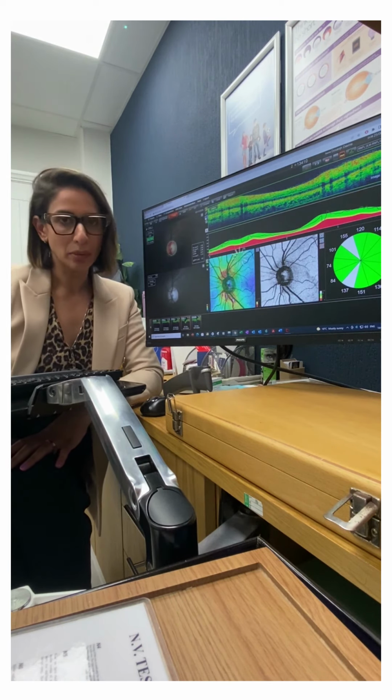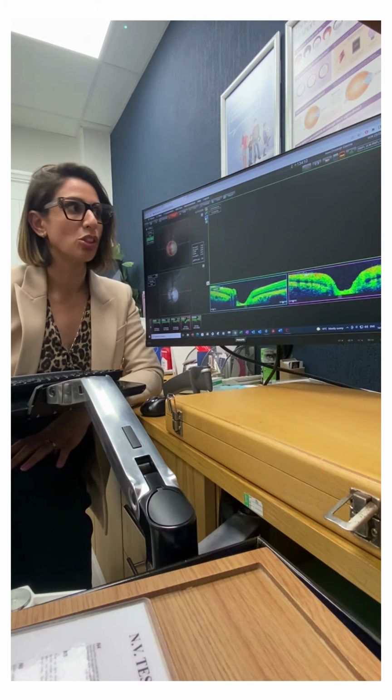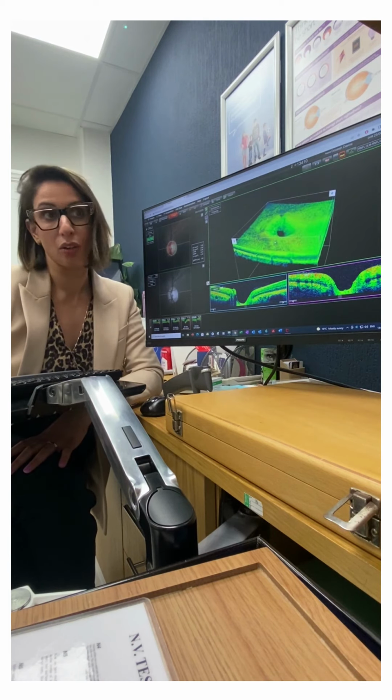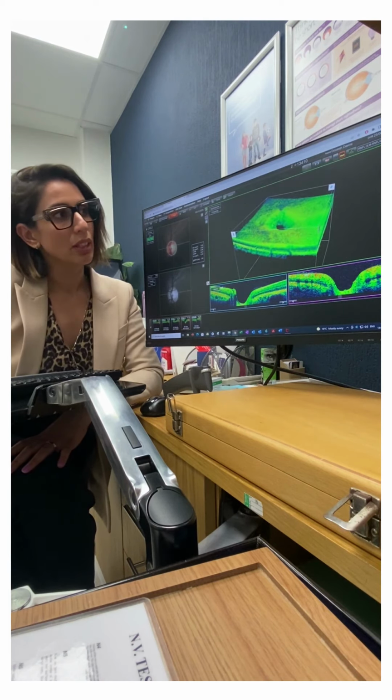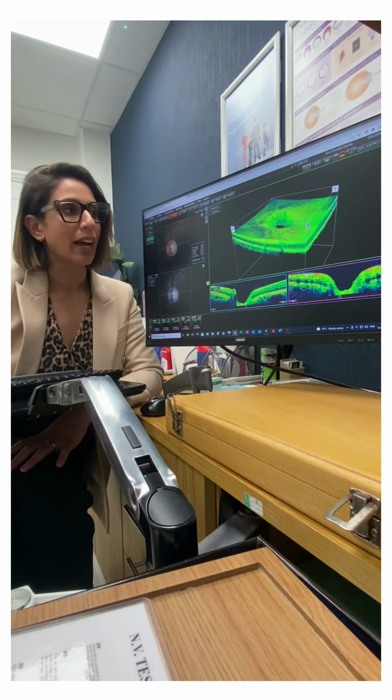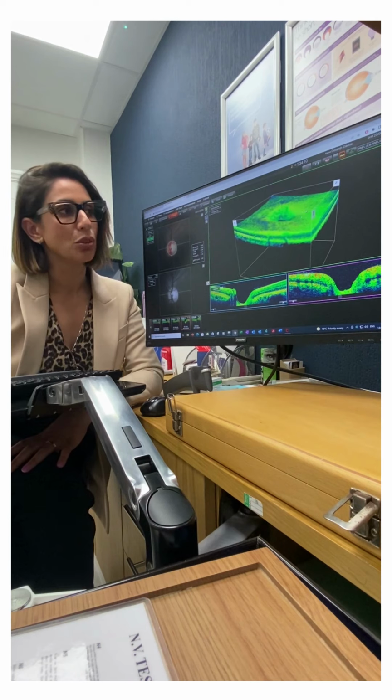And it builds up to put all of those 2-dimensional images together and gives me this amazing 3D model of this area of the eye. So this is the optic nerve head where the nerve fibres are all bundled together. And you can see that it's a layered structure.